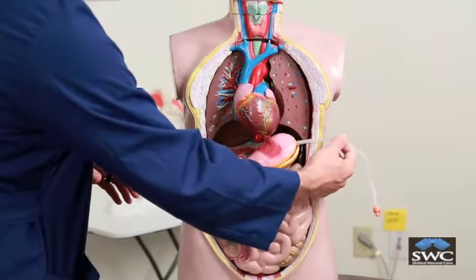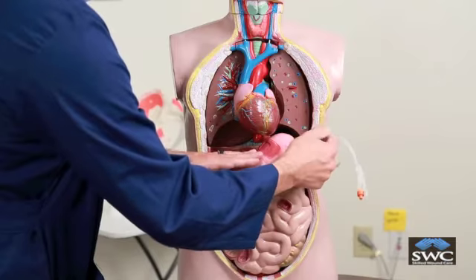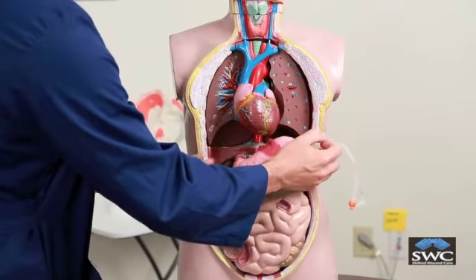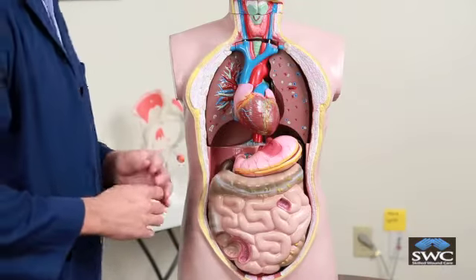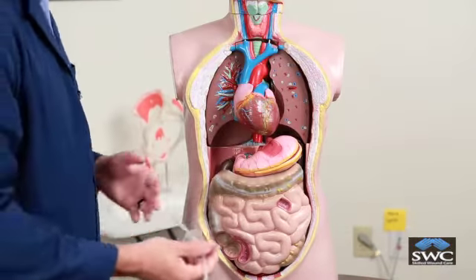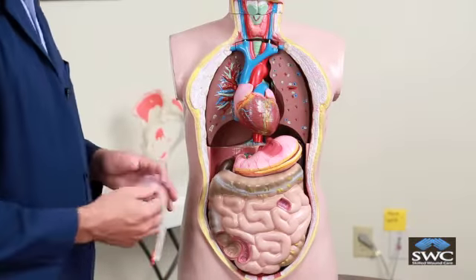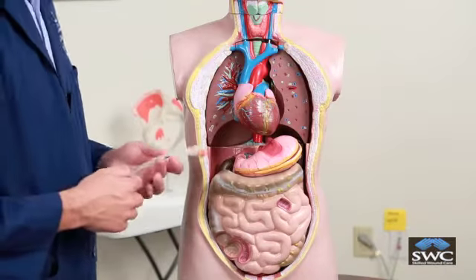The other thing is that if the patient pulls the tube and it's been in for longer than 6 weeks, at that point the facility can go ahead and place a temporary Foley catheter or a temporary tube into the tract. Do not start feeding the patient, and call us to come in and replace it for you, and we can visualize exactly where it has been placed.